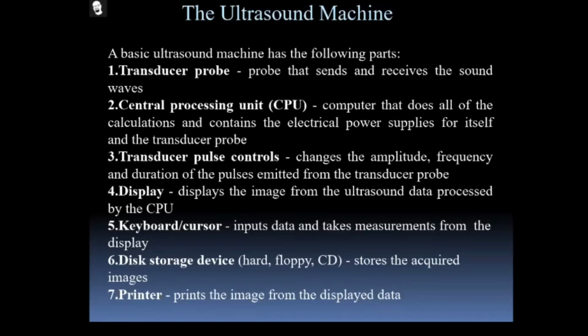Once you place the probe on the skin, we can immediately see what is happening in the internal organs on the monitor. In that fraction of a second, the CPU, the probe, the transducer pulse control, and the software built into the CPU all perform their functions. Only then can we look at the image in a fraction of a second.